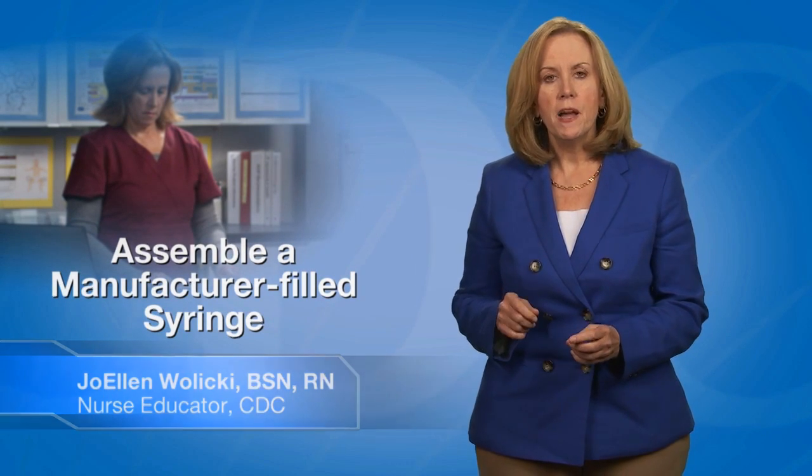In this video, I will describe how to assemble a manufacturer-filled syringe. Manufacturer-filled syringes are available for a variety of vaccines.